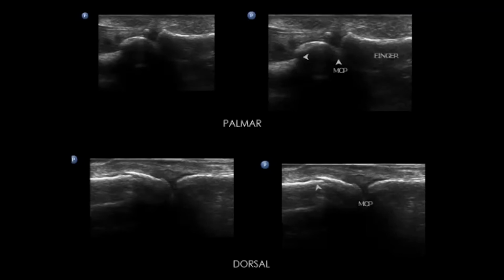any reduction? Well, you can kind of get that from your physical exam, and this one did not require any reduction. And you can also see maybe a little bit of a sesamoid bone there. And again, this is a patient who comes in with fifth metacarpal pain, or pain when they flex their fifth finger at the MCP joint.